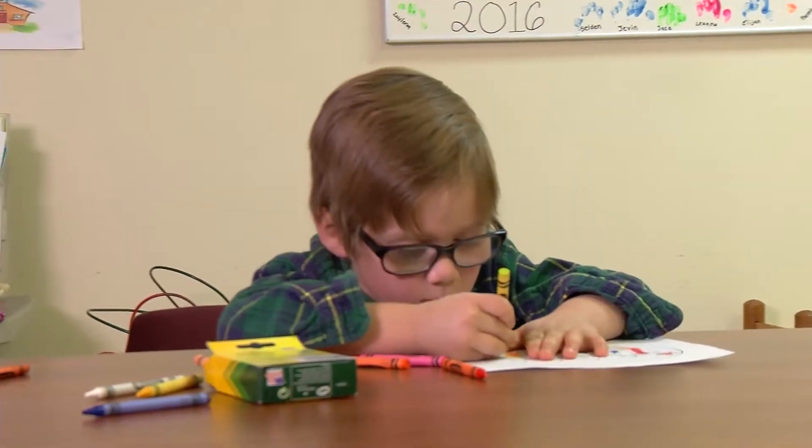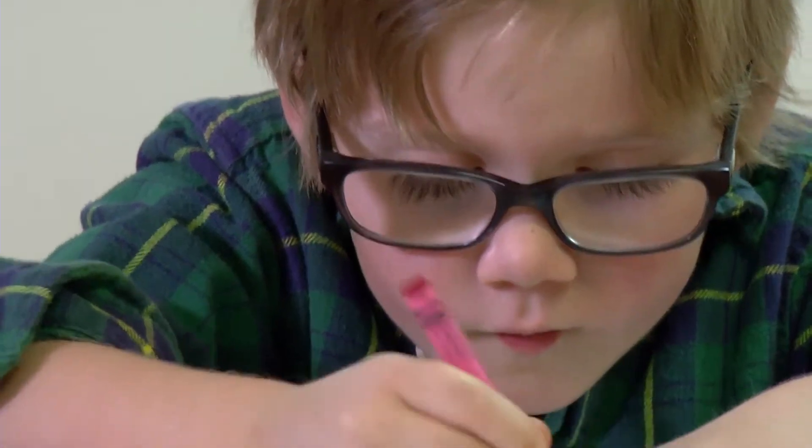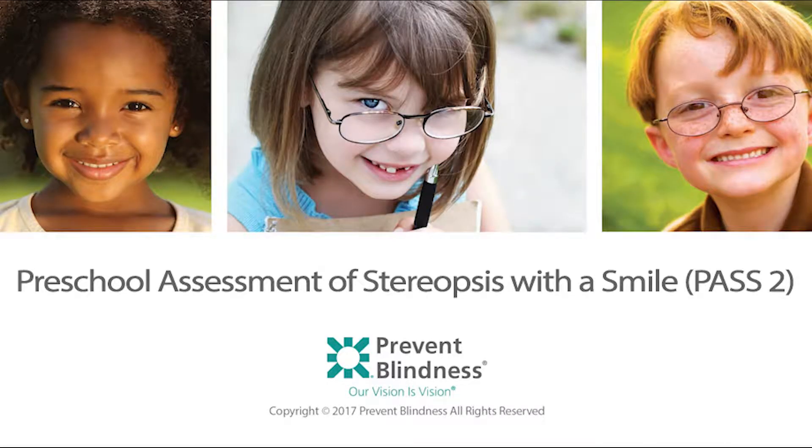Features of a quality screening program ensure that the approach to vision screening is appropriate for the age and abilities of the child. In this brief video, we will review the use of the Preschool Assessment of Stereopsis with a Smile, PASS 2.